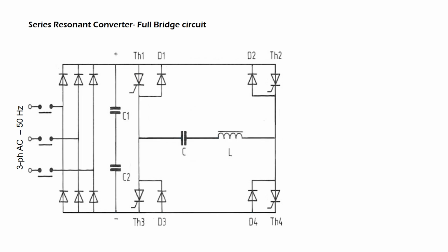The thyristors TH1 and TH4 are blocked while the current is crossing zero. They are not capable of conducting a negative current. The current flow changes its direction and now flows from minus to plus via diode D4, inductor L, capacitor C and diode D1. The force driving this current is the energy stored in the capacitor C, which is now overcharged. The energy is picked up by the capacitors C1 and C2 because the 6 diodes of the power supply unit are blocked for this direction of current.